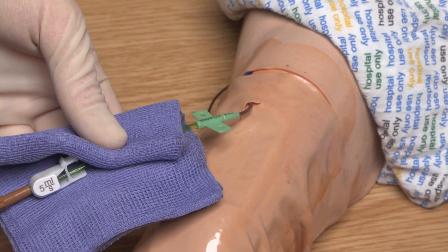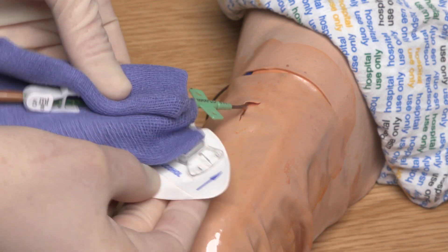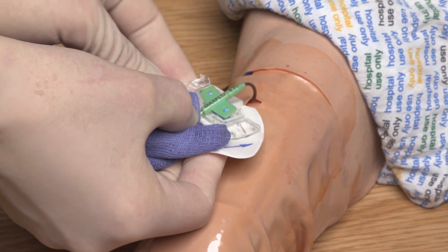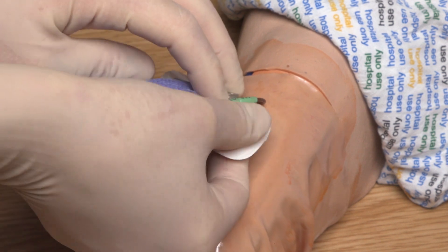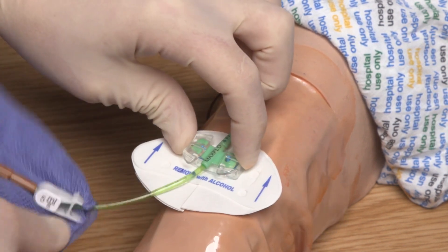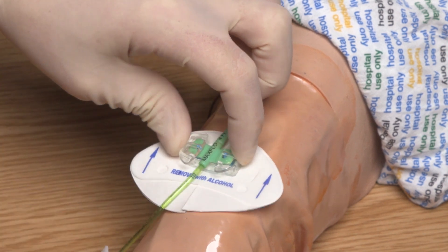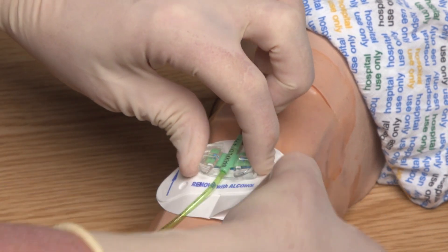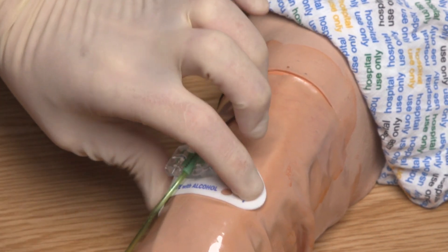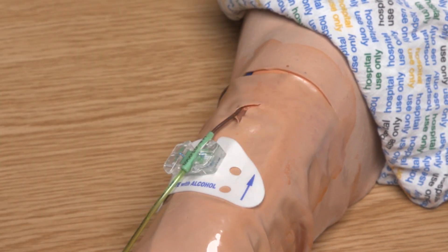Dispose of the used wand immediately into a sharps bin. I am continuing to gently hold the catheter using the sterile swab and I am going to carefully place the new securing device underneath the wings of the catheter, placing the catheter wings onto the blue prongs of the device and then closing over the device doors securely. I need to remove the paper backing on the reverse side of the device to expose the adhesive and then firmly apply this to the patient's skin to secure the device in place.